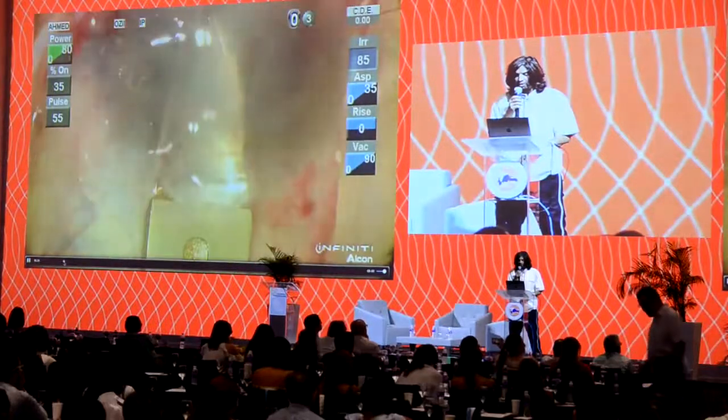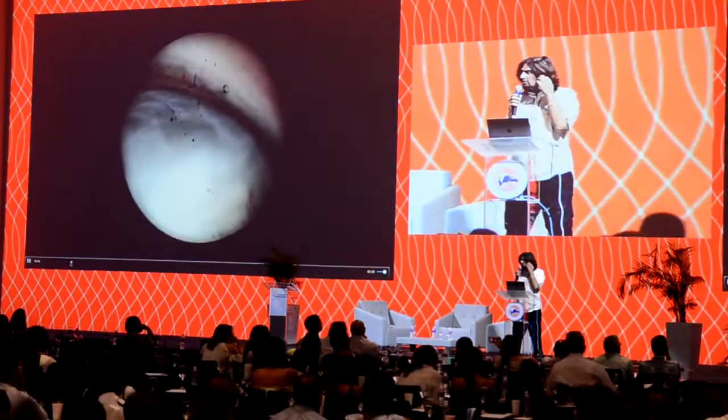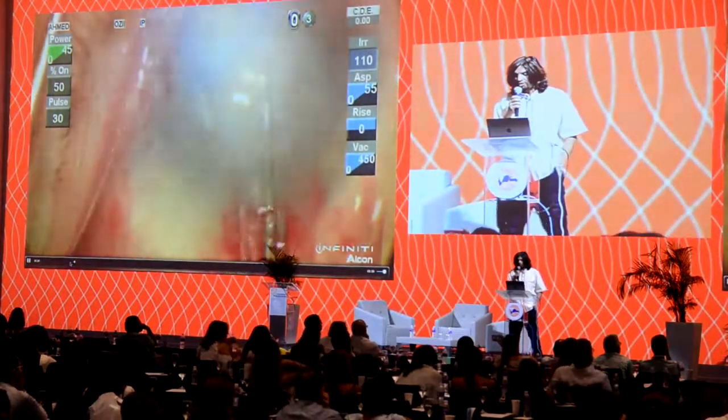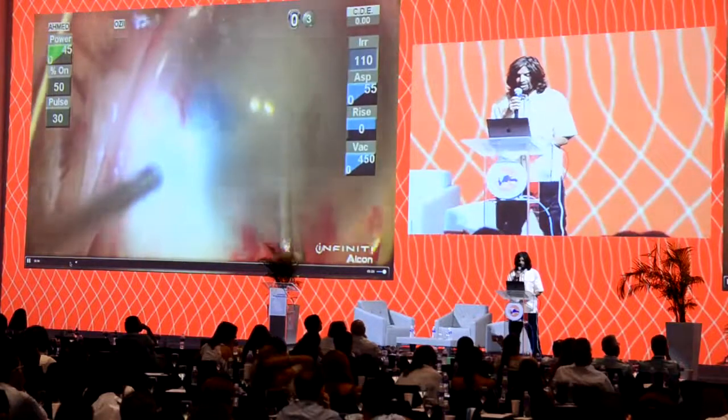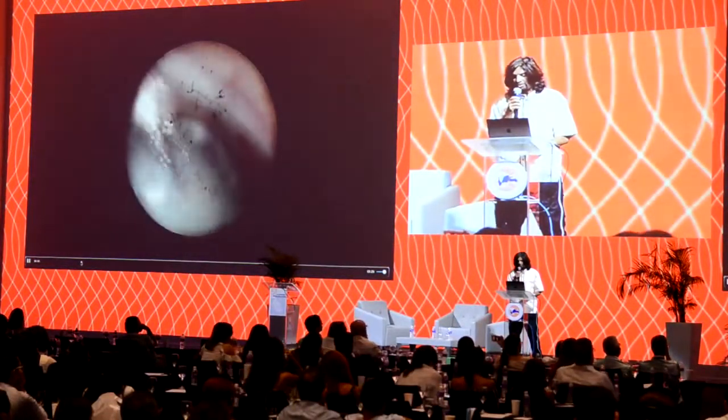So some trypan blue is going to go in. Let's take a look here, and this is where using an endoscope can be very helpful to visualize what's going on there. You see somewhat of a dense cataract there. I wasn't sure whether I was cutting through the anterior capsule, so let me see if I can look. So now we're going to place the endoscope through our main incision.